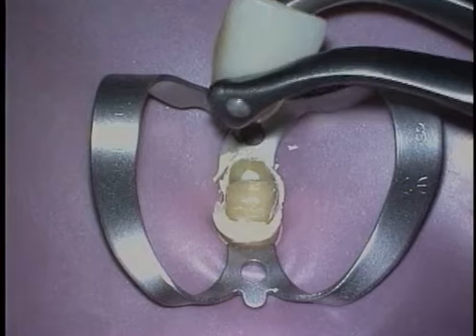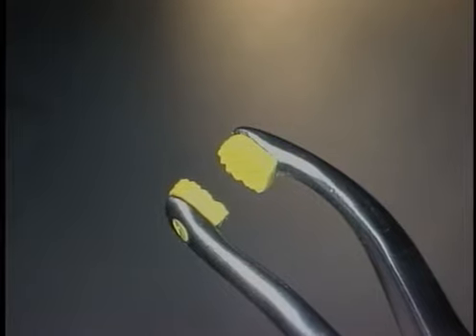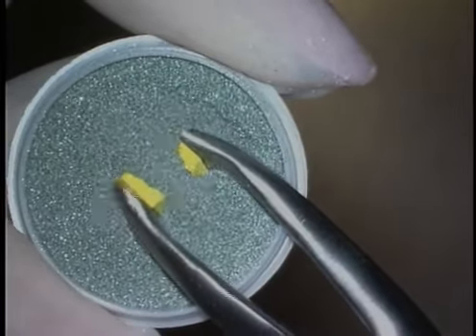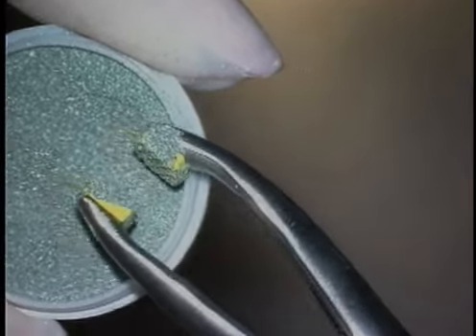effort. For removal of cast crowns or tooth-colored restoratives, rubber packings are inserted on the compressive jaws of the instrument to protect the surface of the crown. The rubber packings can be dipped in emery powder to reduce slippage and encourage a sure grip.